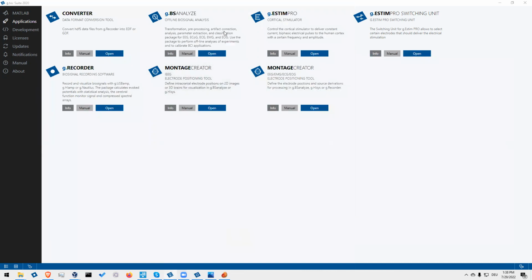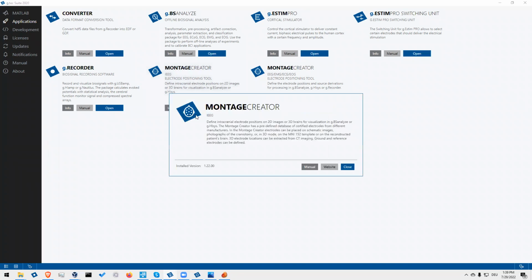Someone has questions. MJ, can you provide us some files for this FreeSurfer import, for example? Or are there any examples included that we can try out? Because I recently tried the standard procedure with the image and the 3D brain, but I couldn't find a FreeSurfer file. So yeah, sure, I can. That would be great. Just let me know where I should put it.